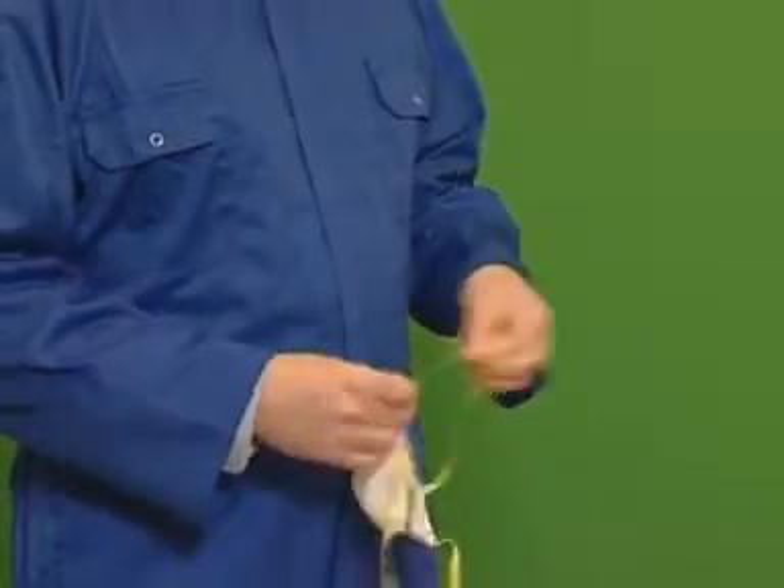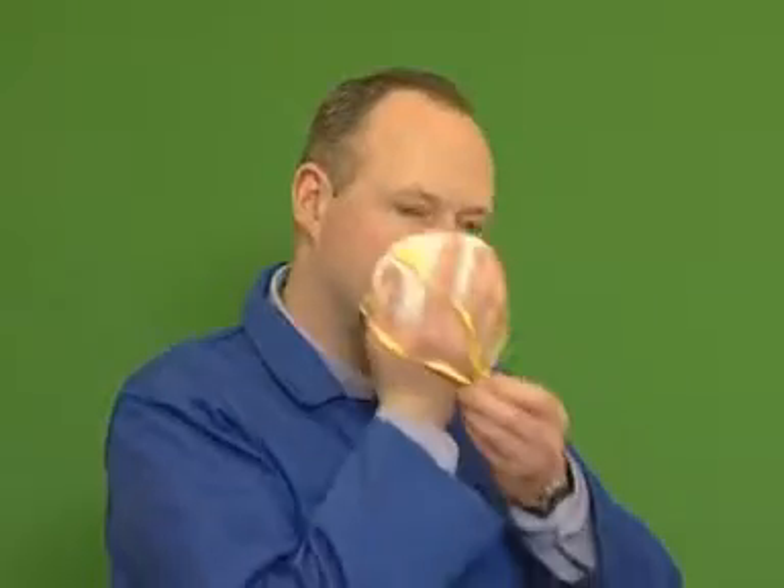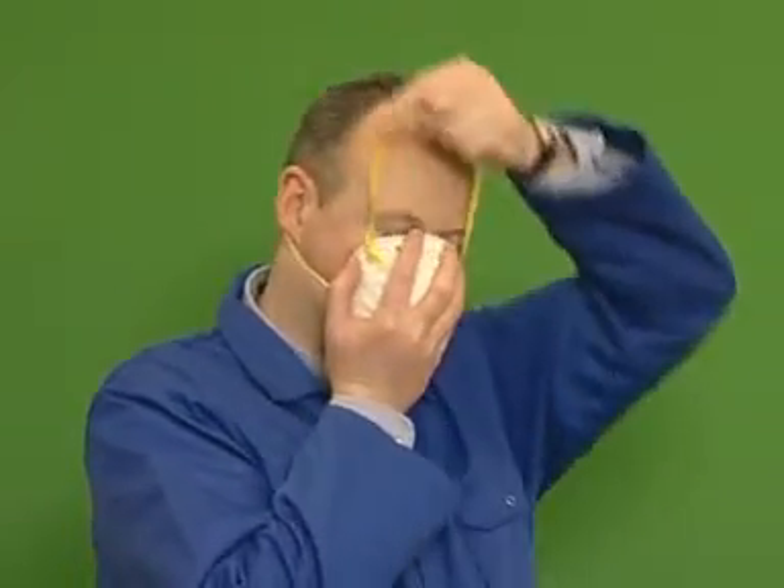Cup the respirator in your hand with the straps hanging freely. Place the respirator onto your face, then position the bottom strap below your ears and the top strap on the crown of your head.